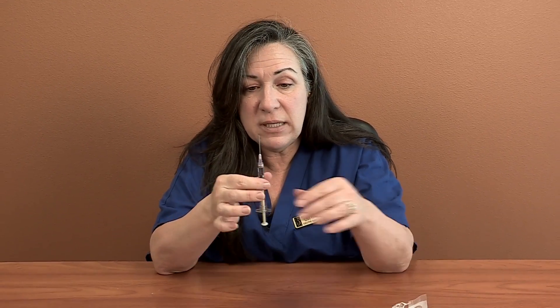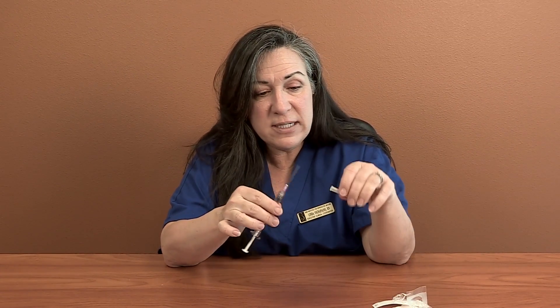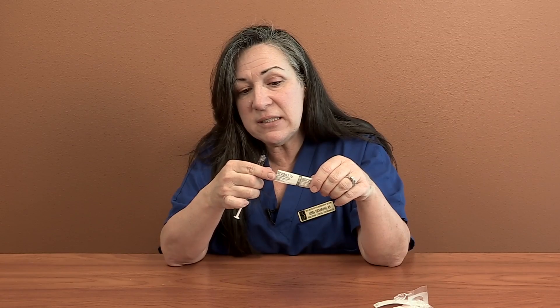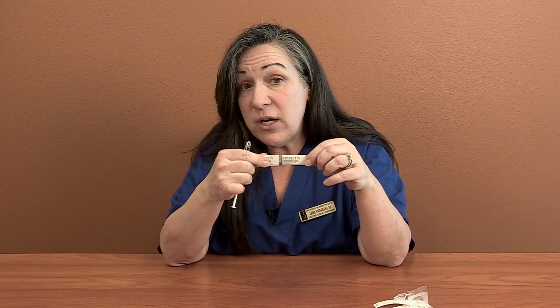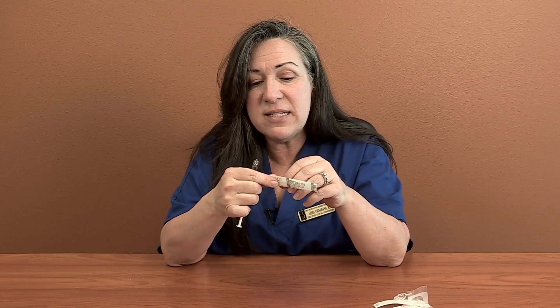Pull that out. I only used that needle to draw with, so I'm going to change it. I like to pull down on the plunger and get all the medicine in the needle before I take it off, then unscrew that right off. I open up my 22-gauge needle — one and a half inches, because this is going to be an intramuscular injection. I did show a demonstration on how to do intramuscular injections under the progesterone section, so please visit the progesterone component of this video to remind yourself how to do an intramuscular injection.